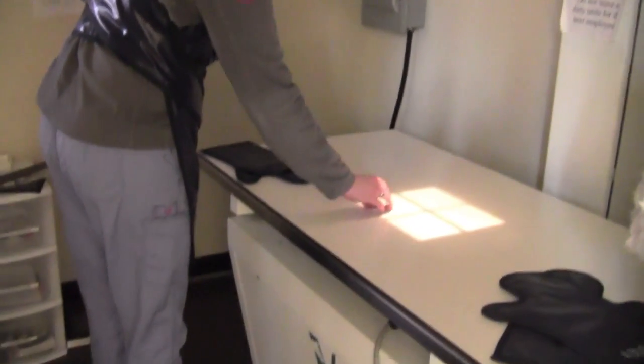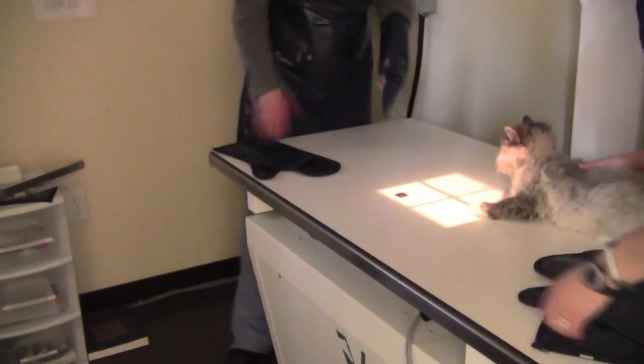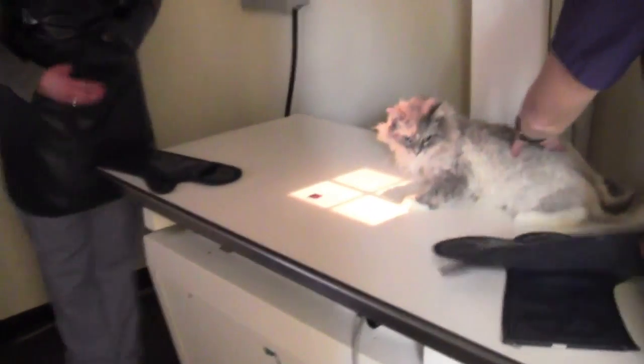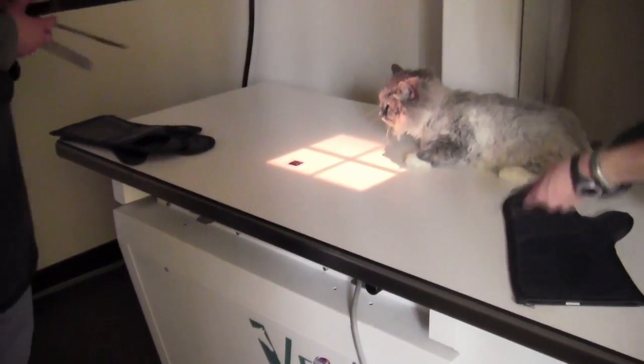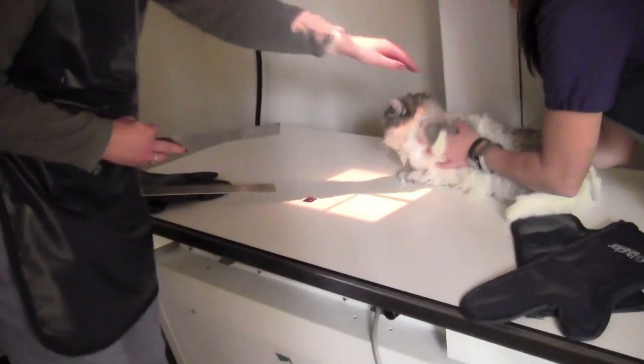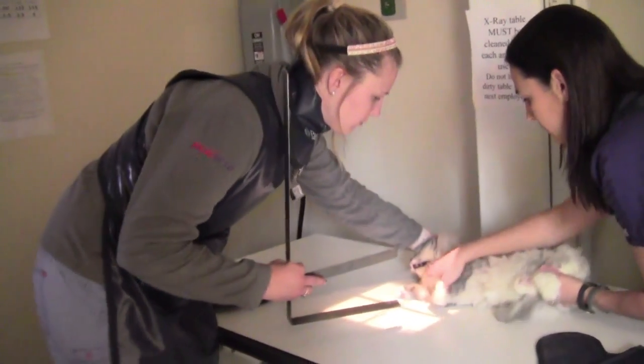A ventral dorsal thoracic X-ray is usually used to evaluate the lungs. After I have entered the patient's information into the computer and selected the VD choice, I will then measure the patient at the highest point, usually around the last rib.